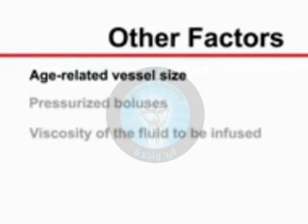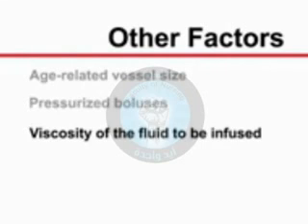Other factors that may influence the size of the catheter used include age-related vessel size, the need for pressurized boluses for administration of contrast or medication, and the viscosity of the fluid to be infused.